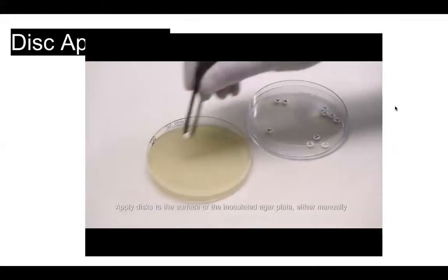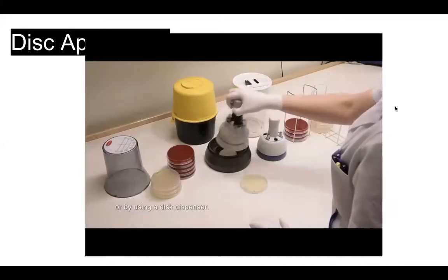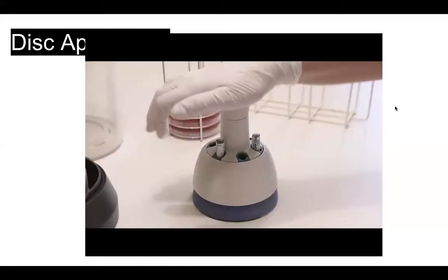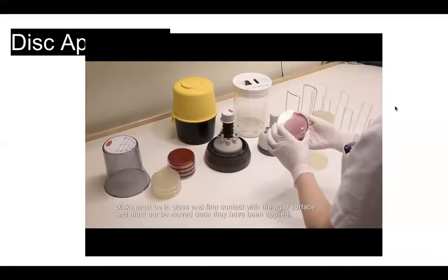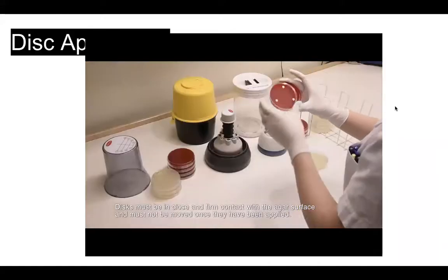Apply discs to the surface of the inoculated agar plate, either manually or by using a disc dispenser. If you do it manually, it's best, obviously, to sterilize the forceps. The discs must be in close and firm contact with the agar surface and must not be moved once they have been applied.